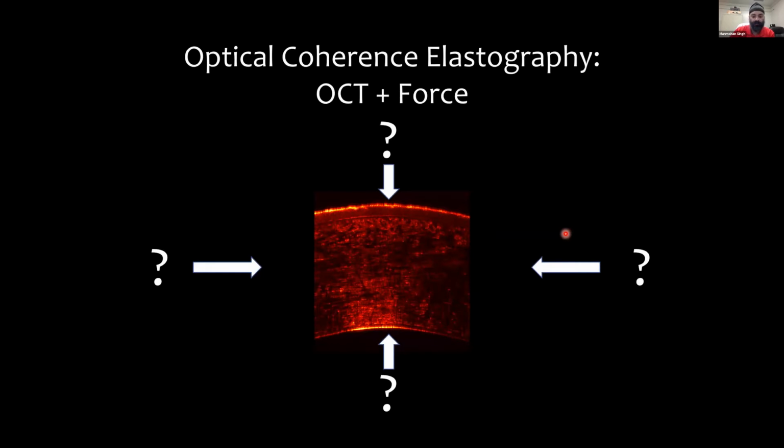And so we're going to use optical coherence tomography, and I'm sure everybody here is pretty familiar with it, so I'm not going to go into OCT, because we want to measure tissues. We're specifically talking about ophthalmological applications, where we have thin tissues, and due to their geometry, shape, and structure, and the resolutions that we're seeking, it's very difficult to use the clinical medical imaging techniques such as ultrasound imaging and magnetic resonance imaging. So OCT provides us a wonderful way to map these biomechanical properties.